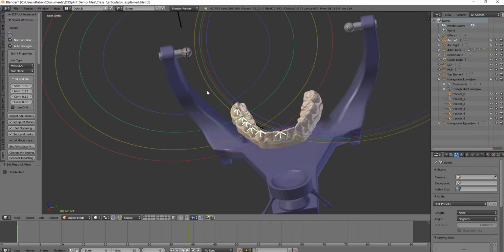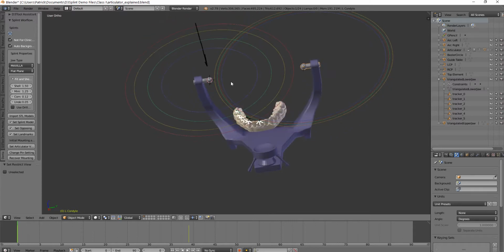I think the closest analogy is in your physical articulators. These little pins have freedom of movement this way because with the Bennett angle and with these tracks being linear, you could never rotate around a single condyle. The articulator would bind. So these have to be able to slide from left to right to allow a pure rotation. And I've reproduced that as much as I can within the limitations of the simulation.